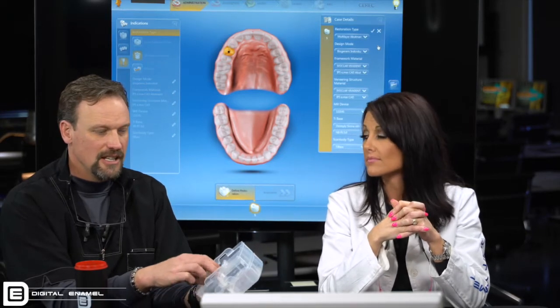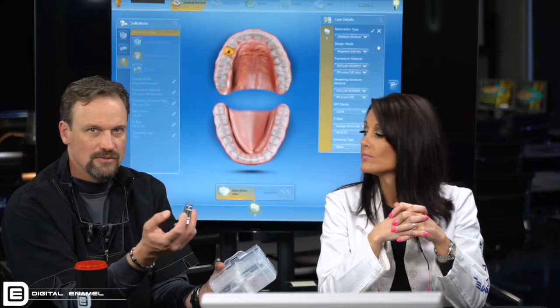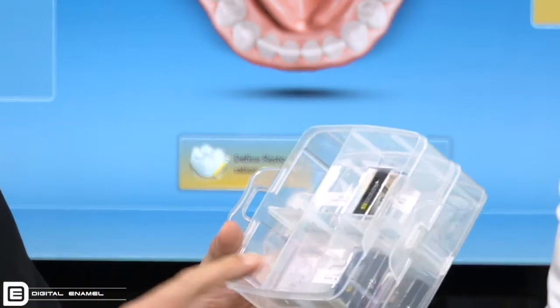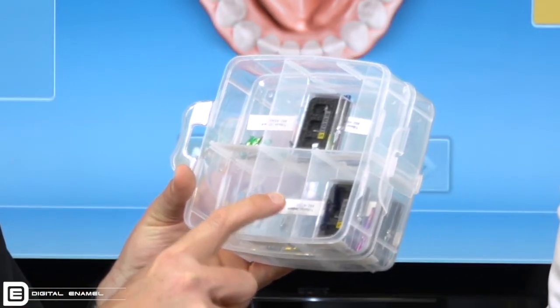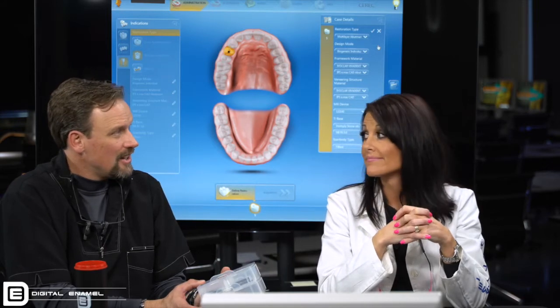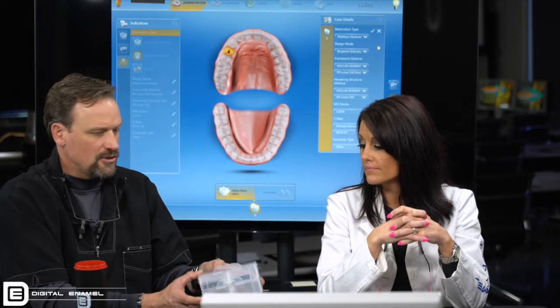Another reason to have the scan post is that if a tie base kit goes on back order, you can still scan the patient in with the scan post and wait for the tie base. When we use a tie base kit, it goes with the patient and comes out of the well. In the bottom of the well, we have the order number for that tie base kit, so as soon as it comes out, we order another one. In the other little wells, you can keep your drivers, extra screws, and things like that.